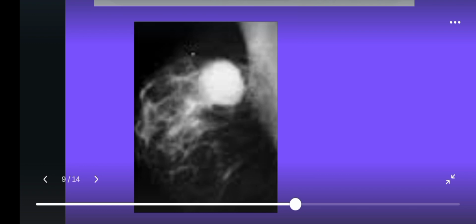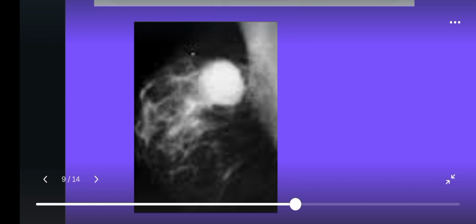Like this is a breast image. This is a tumor which is cancerous. Now during radiotherapy treatment, these surrounding areas that are normal tissue may be killed also in an attempt to kill these cancer cells. And that is the harmful effect I talked about.